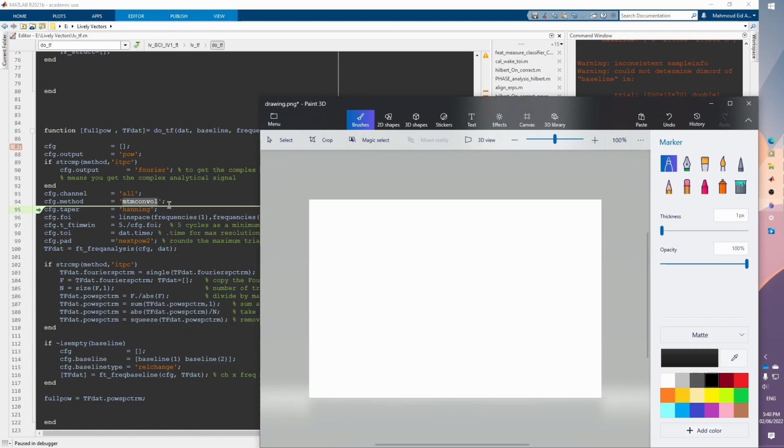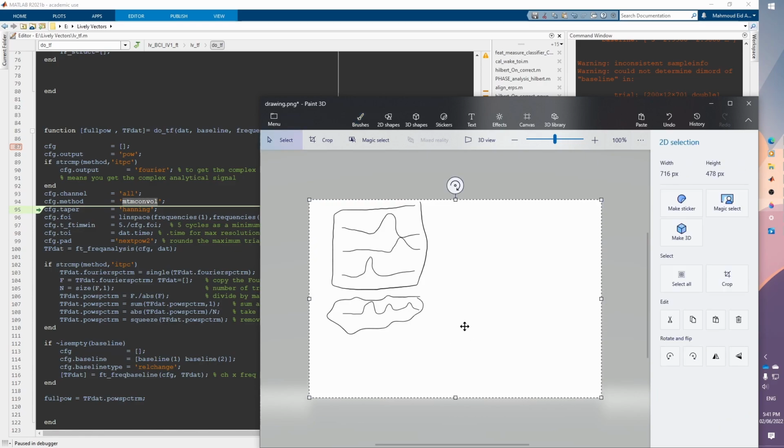might not be perfectly time locked and phase locked to your stimulus, the idea is that if you have something in the first trial that looks like this, and in the second trial like that, and the third trial like that, if you are averaging all of this effect time point by time point, you would get something like this. And the issue with that is this: if you have very small jitter between your trials, you are going to lose the effect when you are getting the average of all trials.